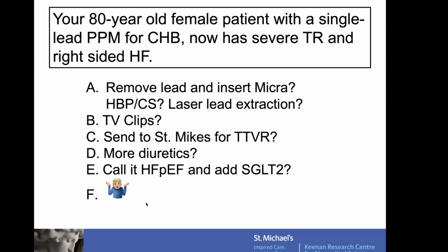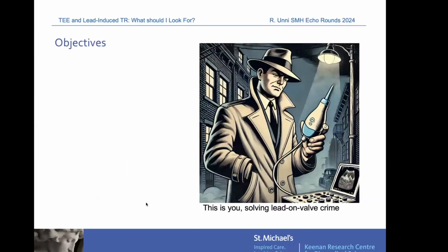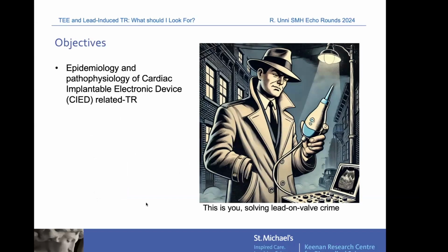It was referral for surgery. And now we have different modalities to remove the leads. We have different interventions on the tricuspid valve. So it's hard to know, with just that stem, what the right step is. And so my hope is that with this talk, we can better illustrate the role of echocardiographers in solving this problem.